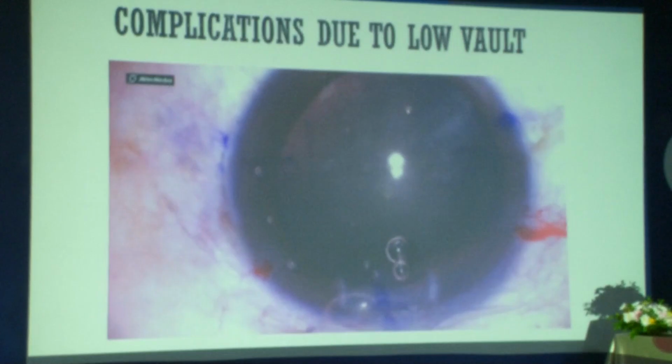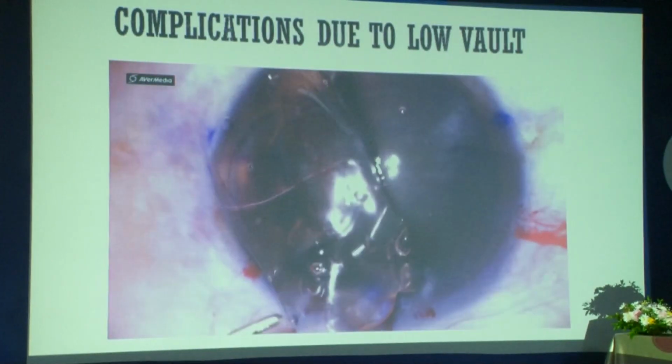And once it is out, you just proceed with your usual cataract surgery.